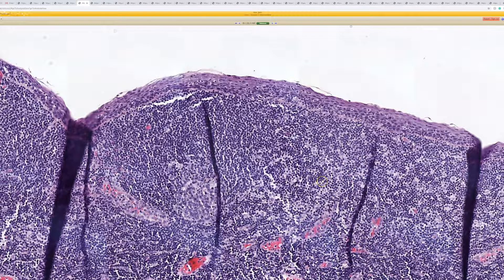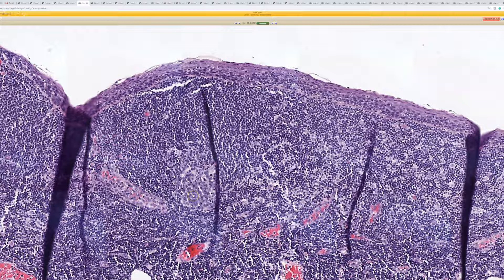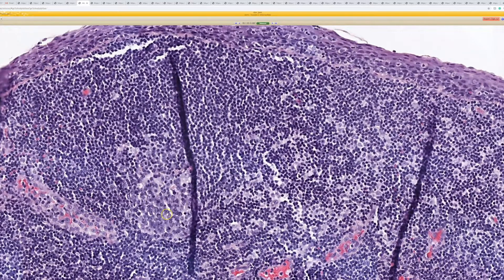And then in the middle of what we're focusing on there, it looks like they're starting to form a little follicular unit, which would make you think, in this context, a branchial cleft cyst. This is a good example of branchial cleft cyst. They're lined by stratified squamous epithelium. They tend to have a really dense lymphocytic infiltrate around them, sometimes with germinal center or lymphoid follicle formation, like we're seeing here.